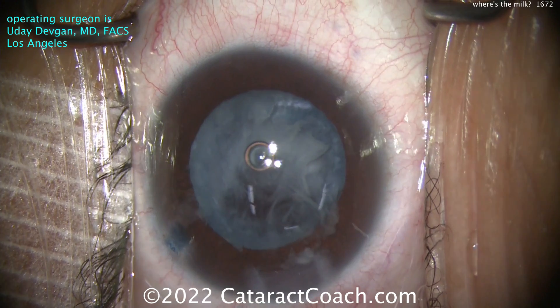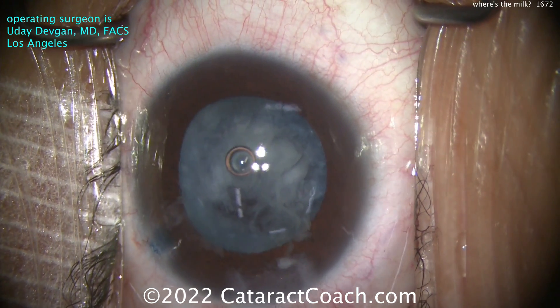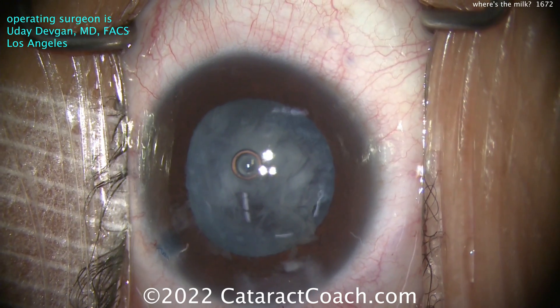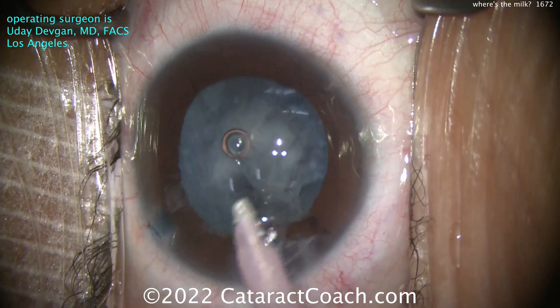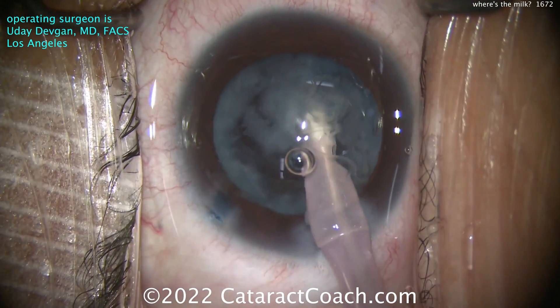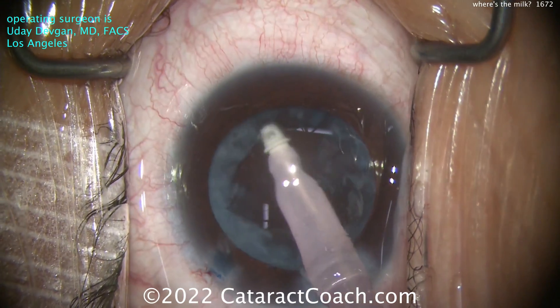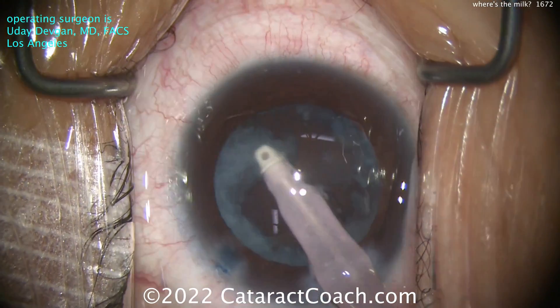The cortex is still adherent there. You can try to take some with the phaco probe if you'd like, or a safer option here would be just the IA probe - so we'll switch over to that. Not all cataracts that are white are going to have intumescence in them. There's a video on CataractCoach called 'Differentiating White Cataracts' - I'm not going to show you on YouTube, you've got to go to CataractCoach.